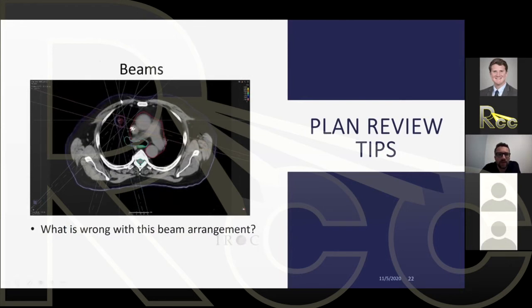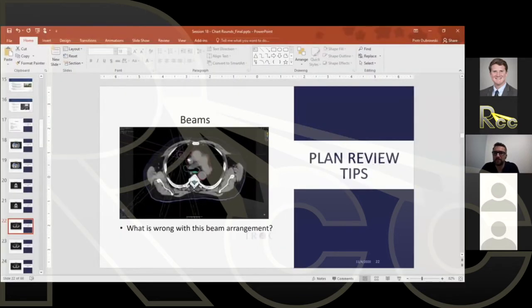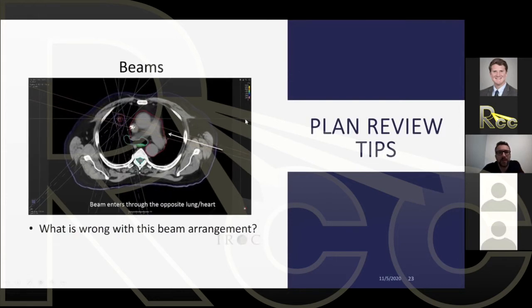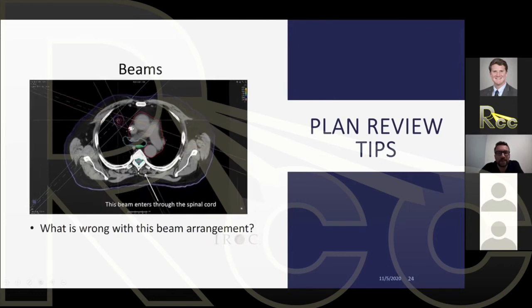Now looking at beam arrangements — not contours. Can you find issues with these beams? One beam comes in through the contralateral lung, far from the target. It's probably not delivering much dose to the target but is contributing dose to the contralateral lung and heart unnecessarily. Another beam enters through the spinal canal and spinal cord — that's probably not a good beam arrangement choice.